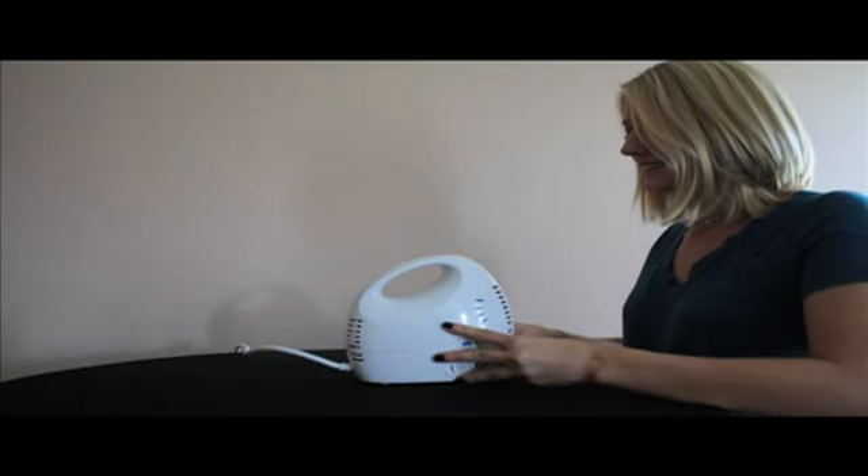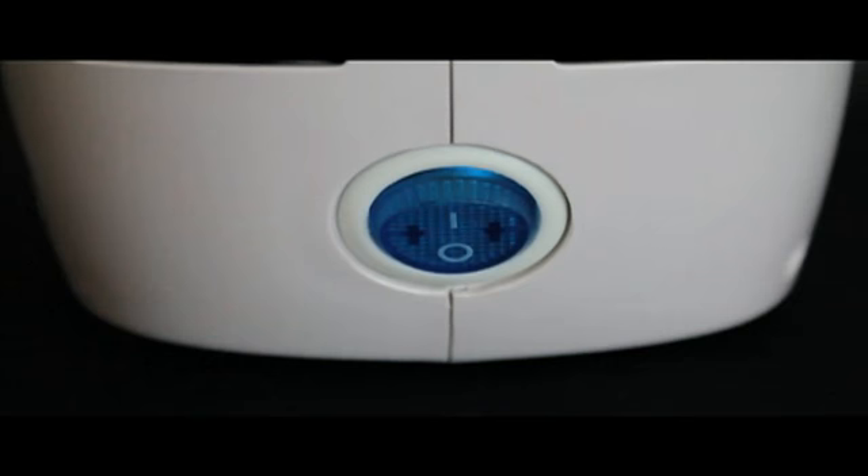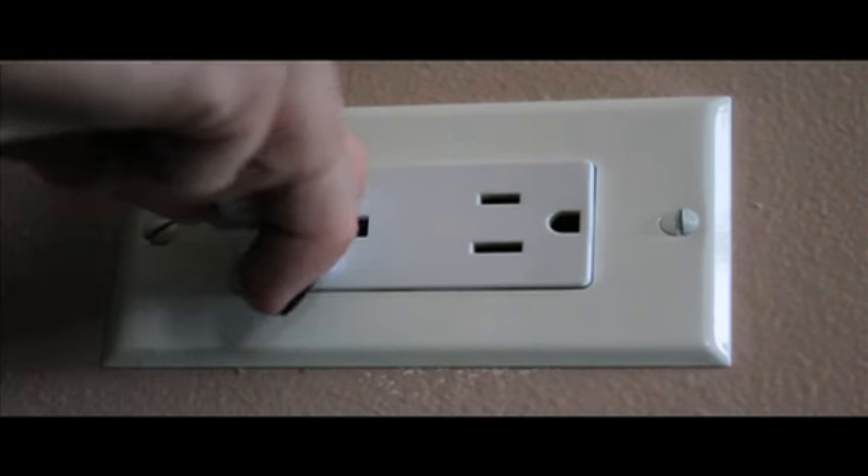To operate the Mini-Comp, place on a flat, stable surface with the handle facing you. Make sure the power button is in the off position. Plug the power cord into an electrical outlet.